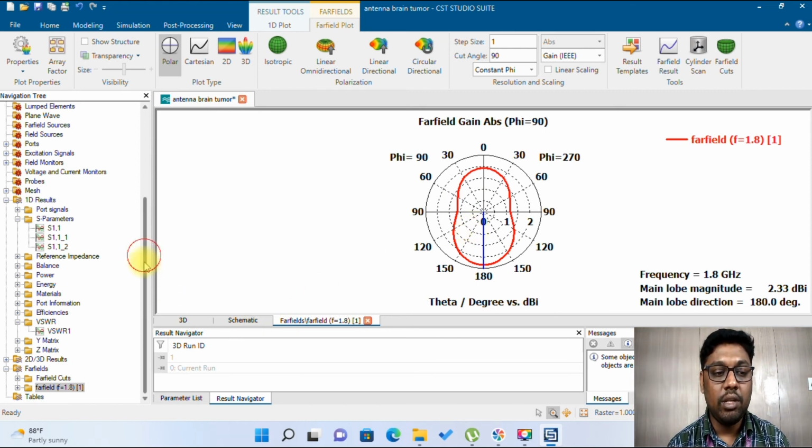So apart from this, you can generate the current distribution graph and the efficiency of your antenna. This is basically for F equal to 1.8, where you can see the directivity and gain. If you need to analyze directivity and gain for a broadband, you can make a separate simulation for that. I will post one video for that. So this is all about the design part.